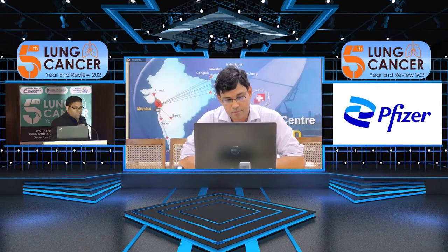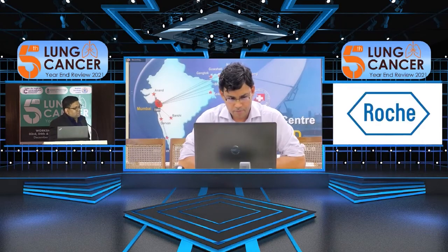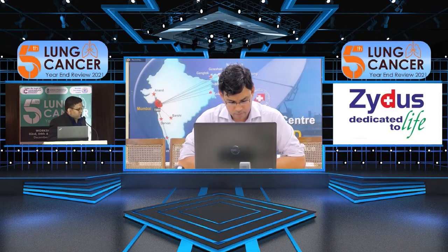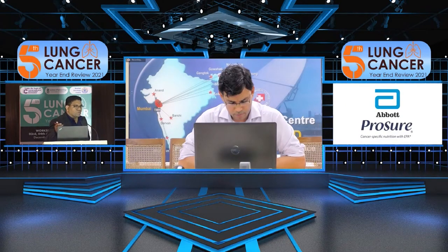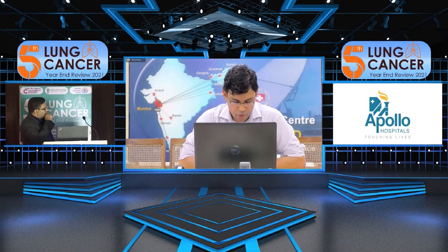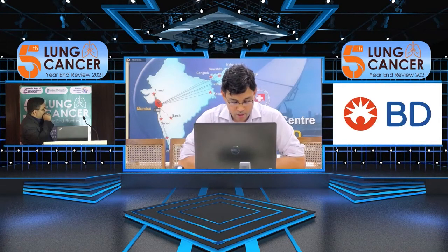Okay, thank you. Amit, one more thing. Let's say a patient had a single brain met and undergoes SBRT. How easy or difficult is it for you, when you do response assessment scans, to say that this is tumor necrosis versus tumor progression on subsequent MRIs? I will tell you, 90 to 95% of the time we can tell whether it is tumor progression or post-RT change.